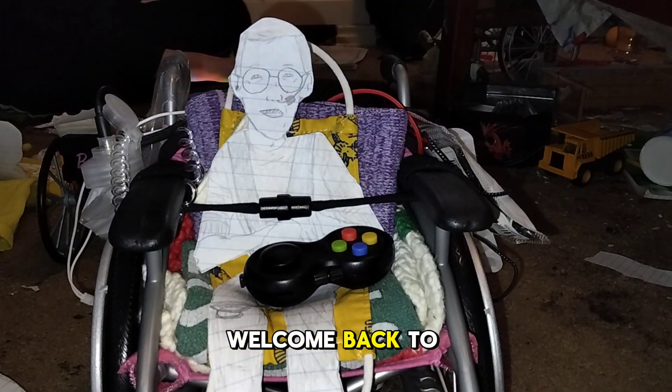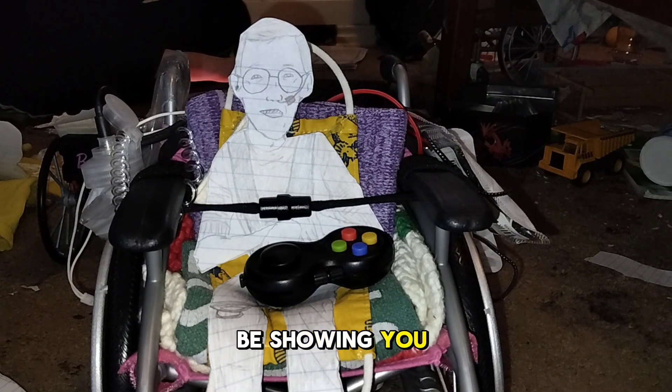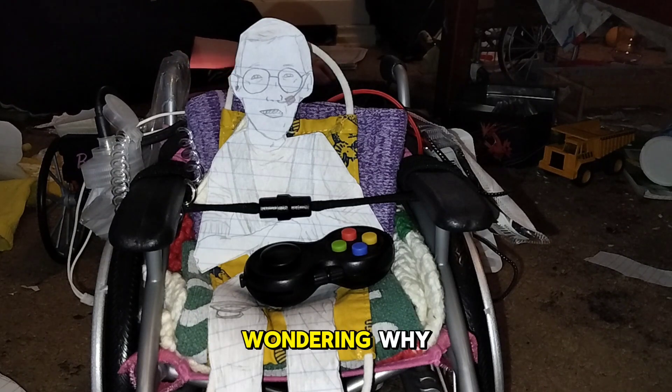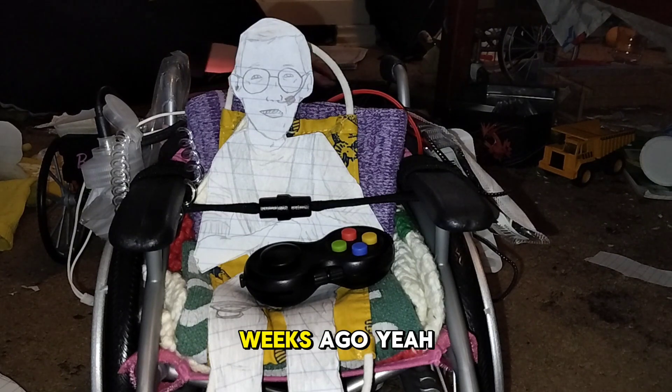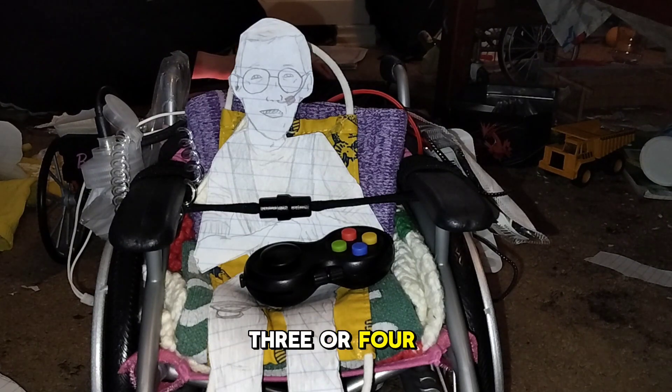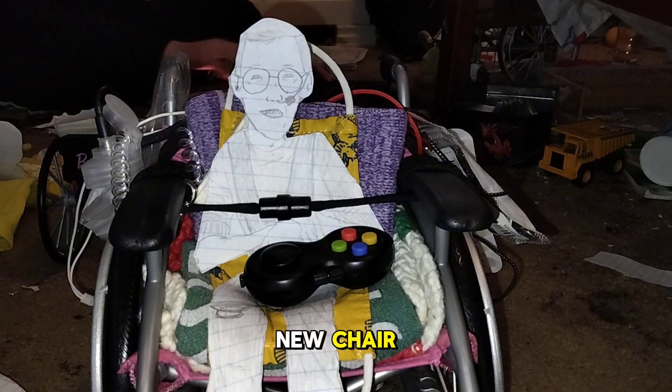Hello everyone. Welcome back to another vlog of Autism and Disabilities. Today I'm going to be showing y'all my new chair. You're probably wondering why — we did wheelchair changes a couple of weeks ago, about three or four weeks ago, and I don't think we uploaded a vlog on that. So we're going to be showing my new chair.